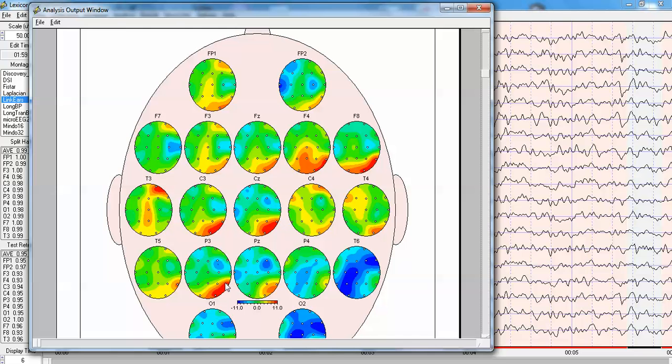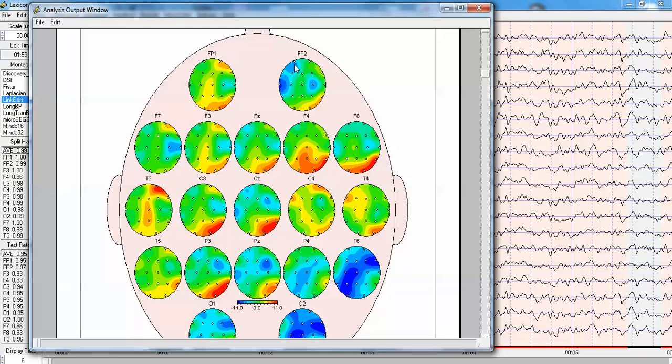Here P3 has a net flow of information to T5 and O2. And in this case with FP2, it has a flow from FP1 or F7, F7, and also from T3.